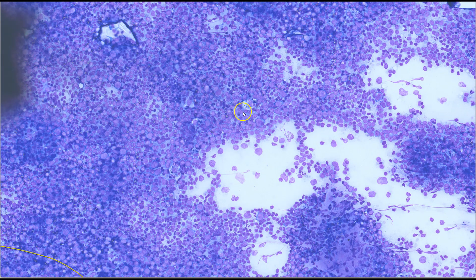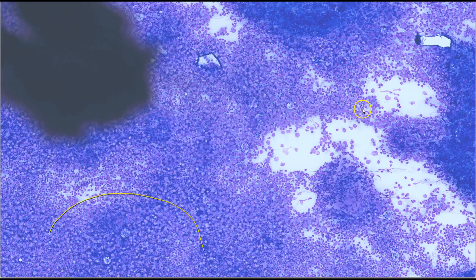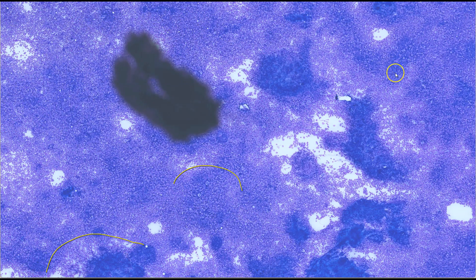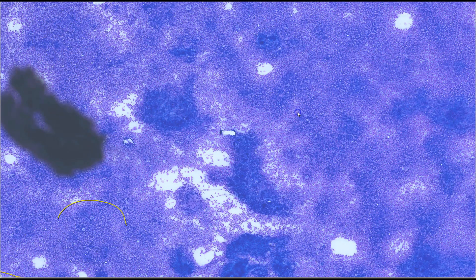Tingible body macrophages are not exclusive to reactive lymphoid lesions. They can also be seen in malignancies, and in particular in Burkitt lymphoma we can see lots of tingible body macrophages.